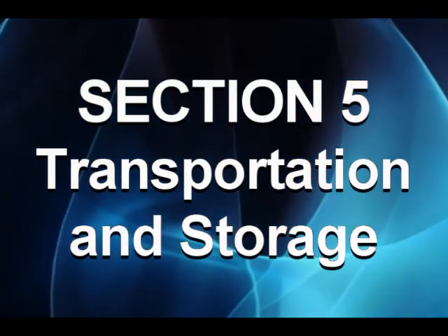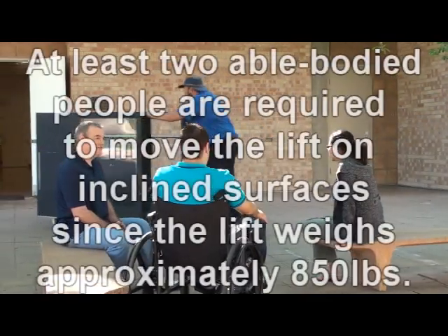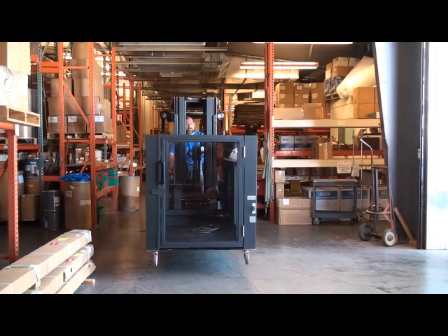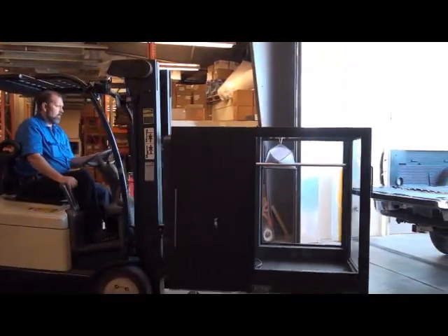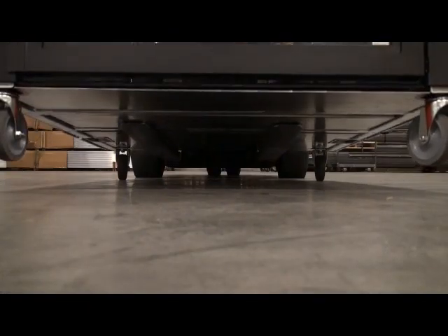Transportation and storage: one person can easily move the lift on a level, hard, and smooth surface. At least two able-bodied people are required to move the lift on inclined surfaces since the lift weighs approximately 850 pounds. For movement over rough surfaces, long distances, or steep inclines, a forklift is required. Prepare the lift for transport and approach the lift on the upper landing side at the underside of the base.